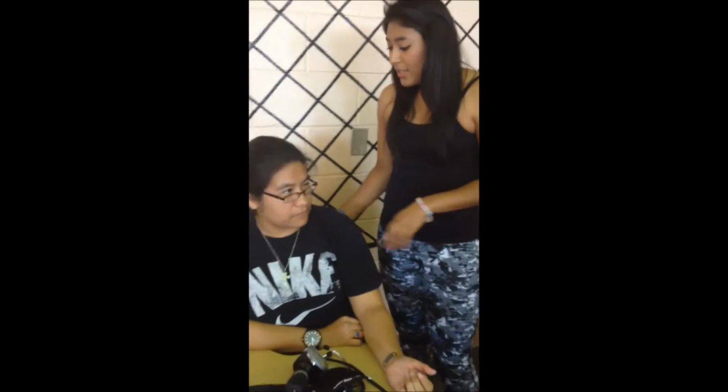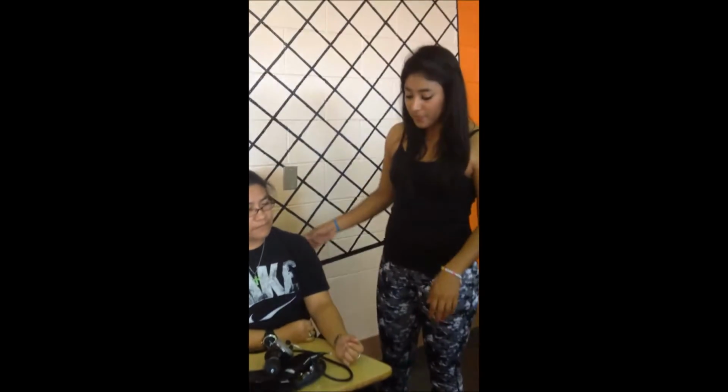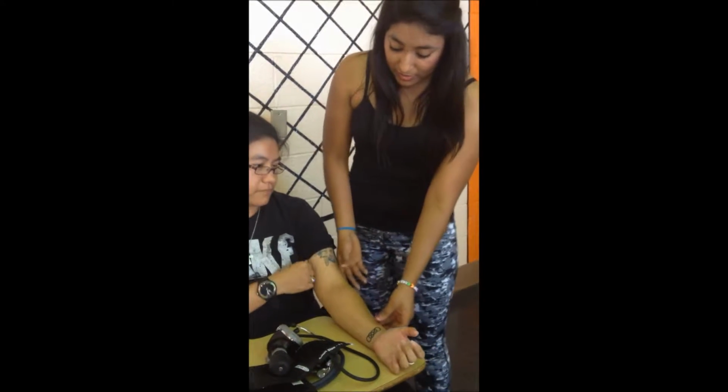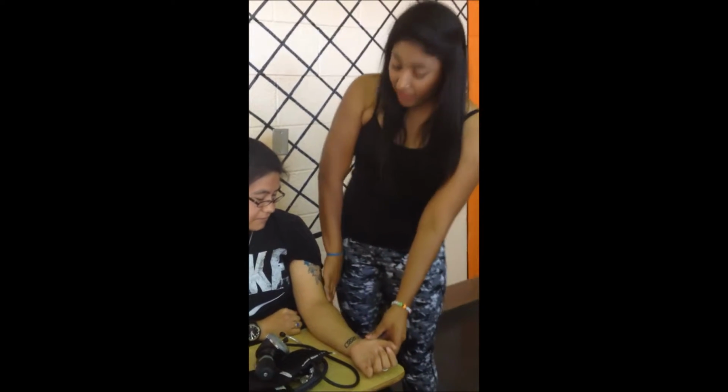To continue, make sure that the patient is seated and has support on the back. For the feet, they have to be flat on the floor and do not cross the legs. For the arm, it has to be supported, relaxed, and free from any clothing. And it has to be at about heart level.